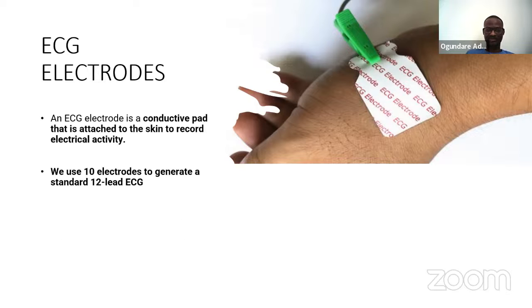We use 10 of them to generate the 12 leads. So the 12 leads that I've mentioned, we actually use 10 of these electrodes to create them. And that will be the next thing I'll be showing us.